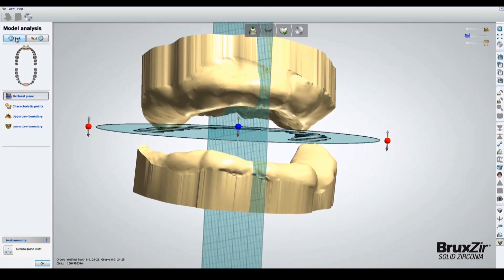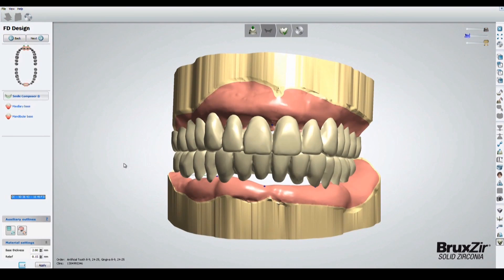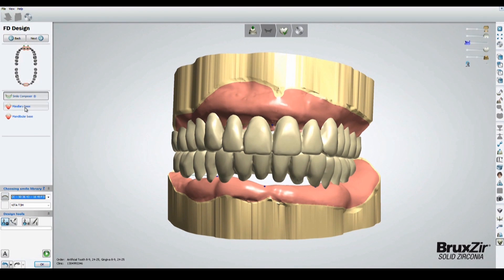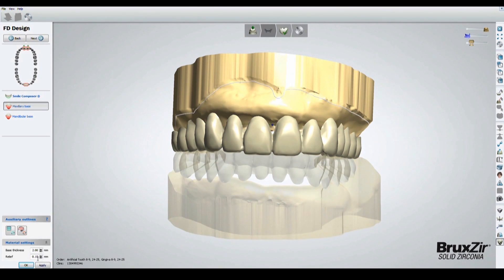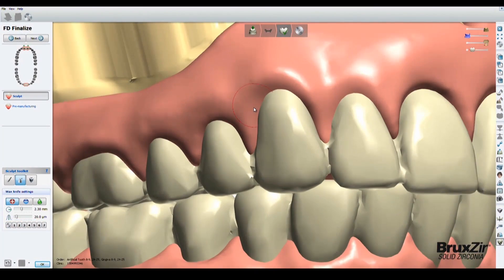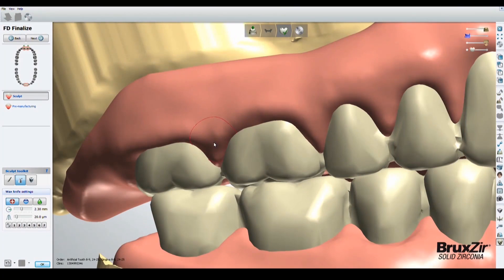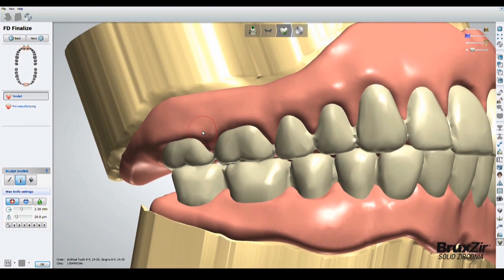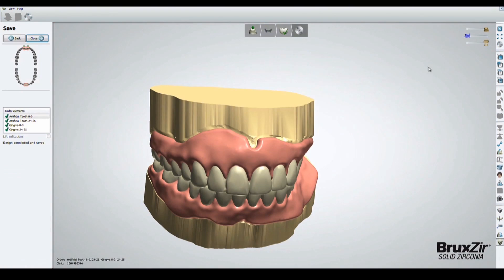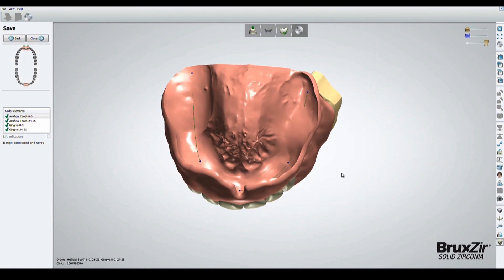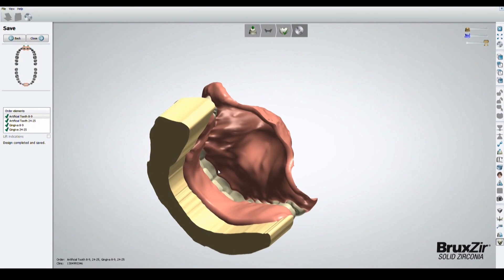The next step is to import the denture teeth into the software. We've already established our occlusal plane and only need slight minor adjustments. What I really like and am impressed with is the ability to festoon the gingiva while the denture is being designed. Using the festooning tool, the technician can go around each tooth and add or remove wax as needed. We have a nice 360-degree view of what the final denture is going to look like.